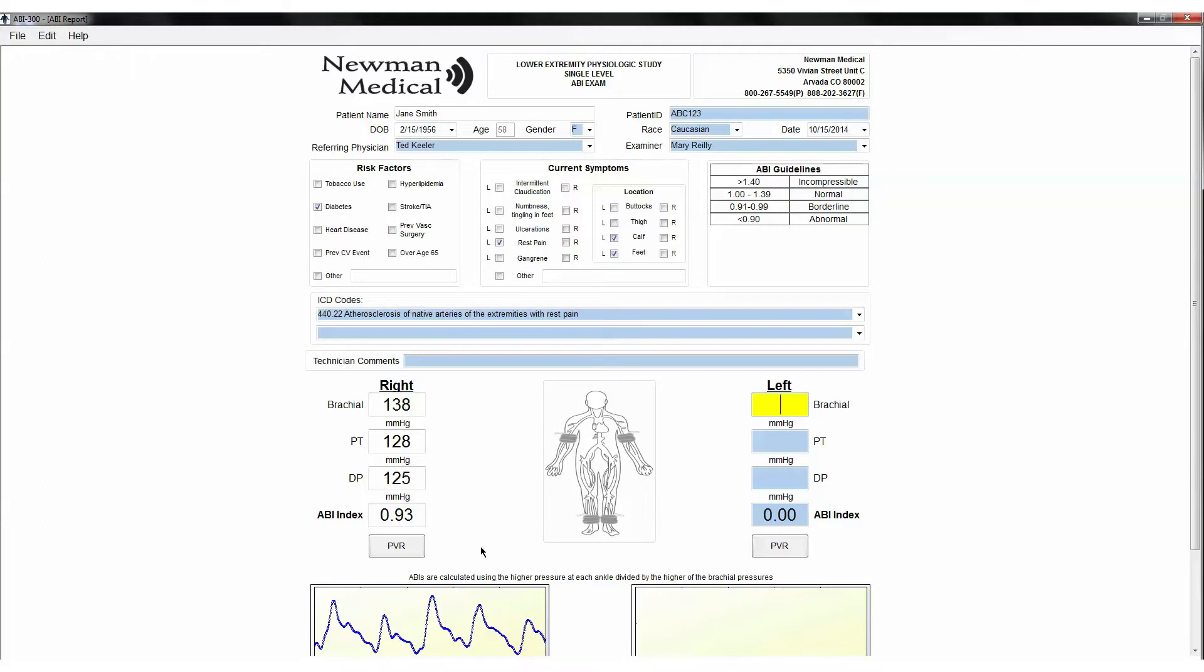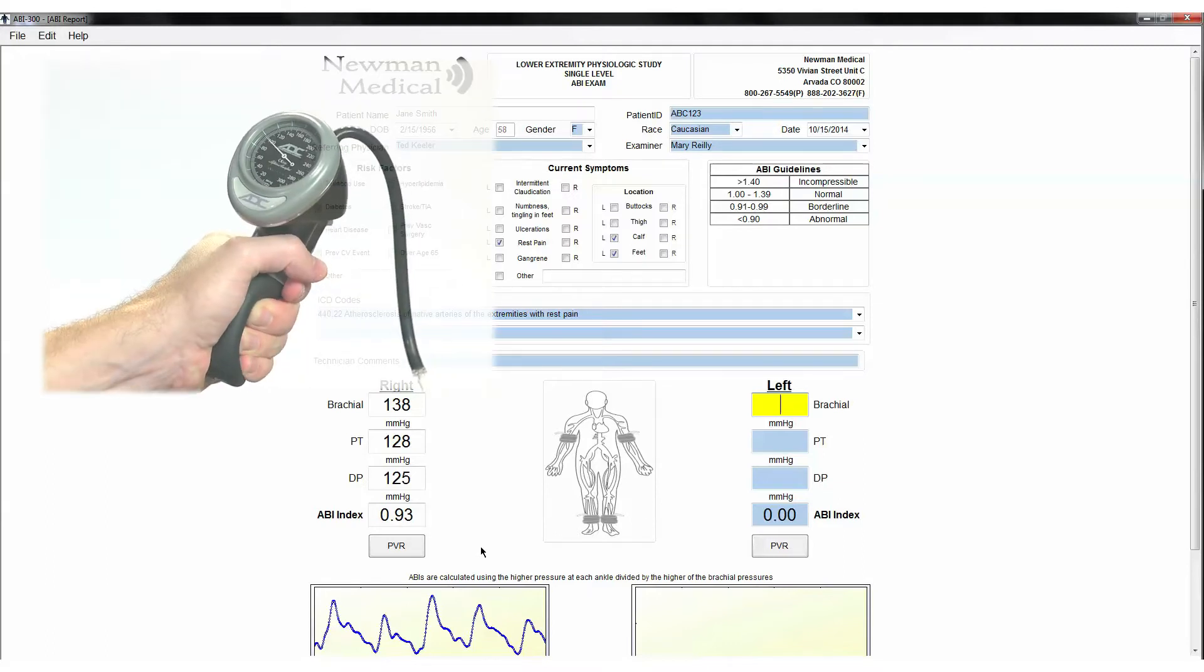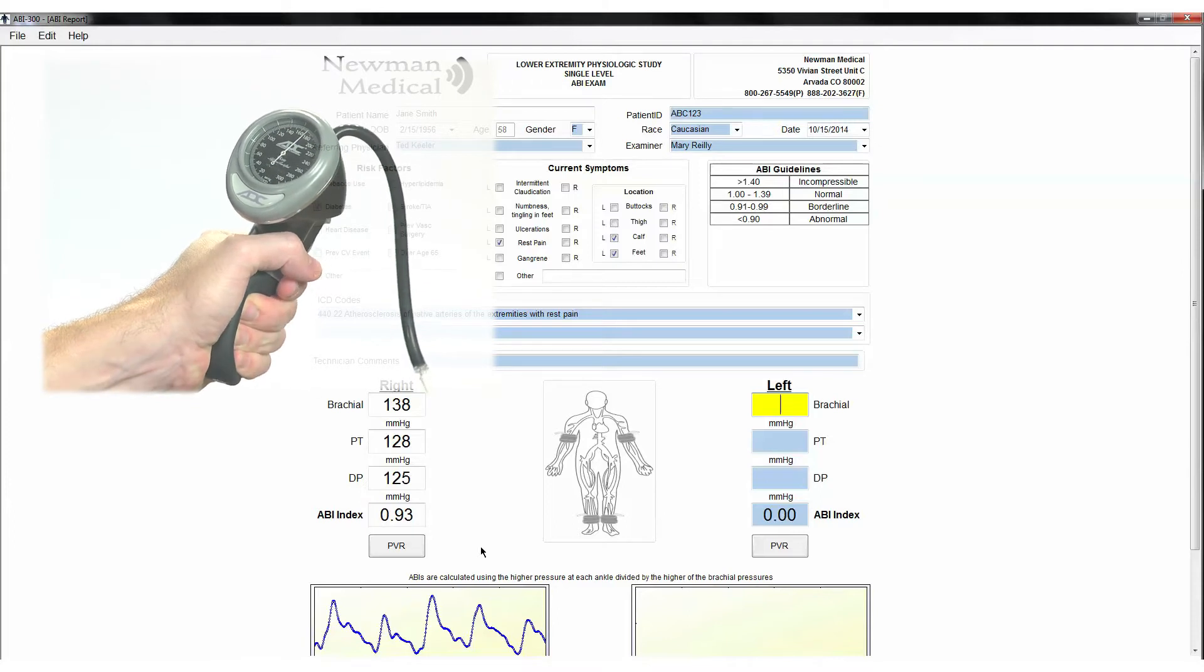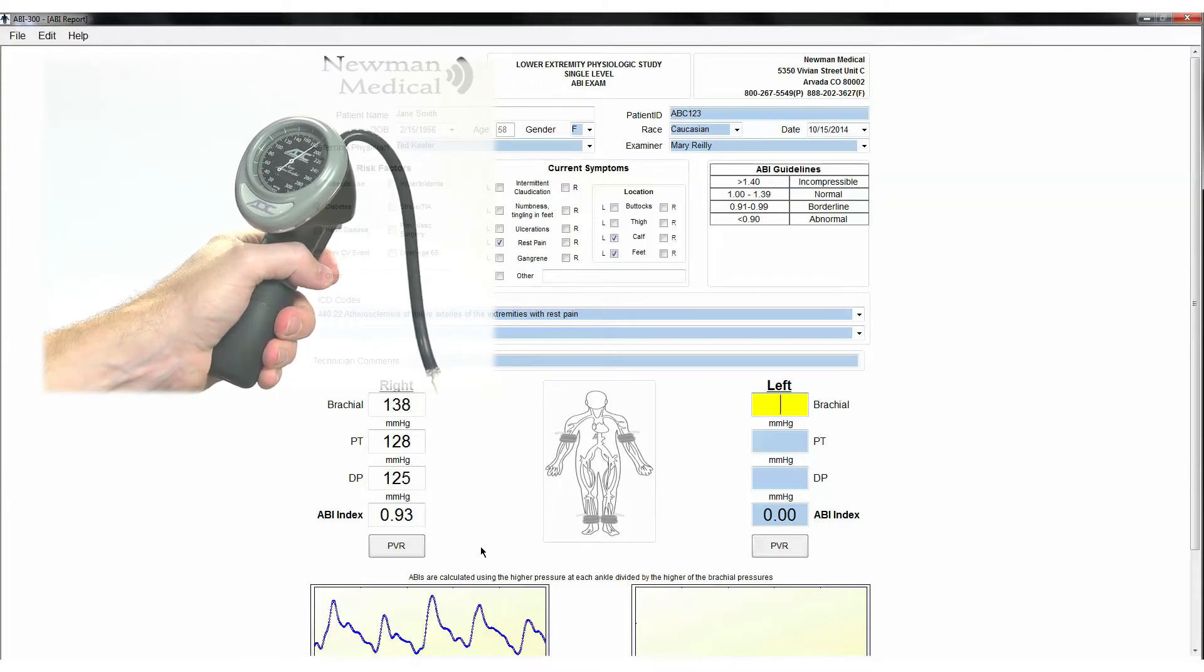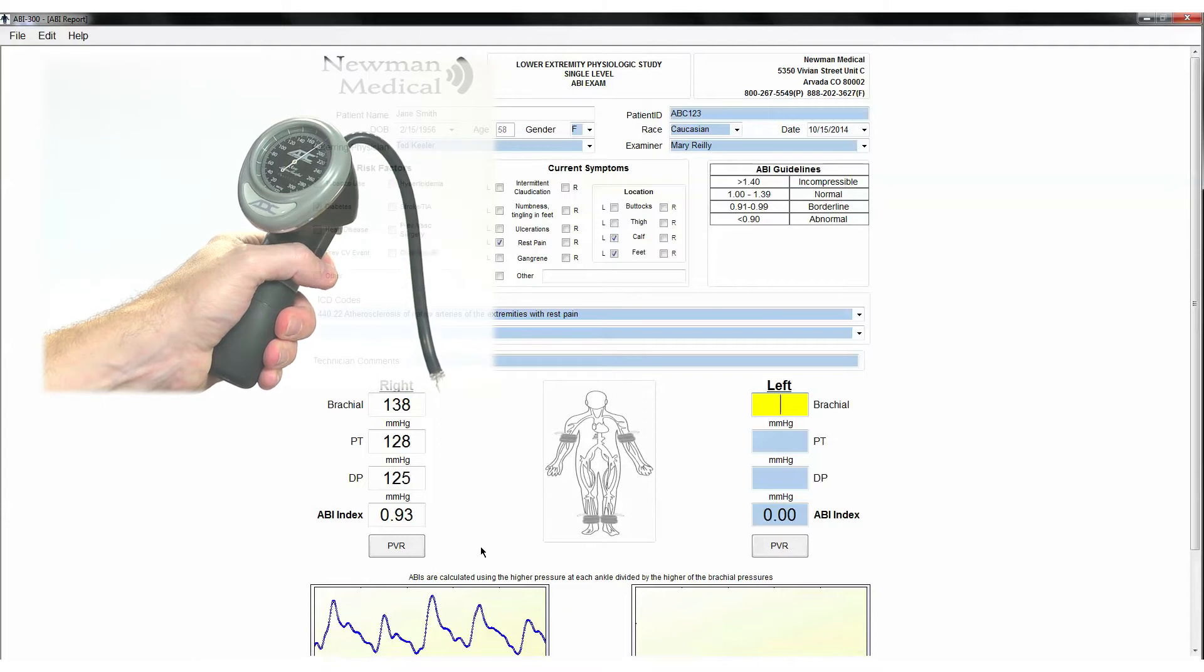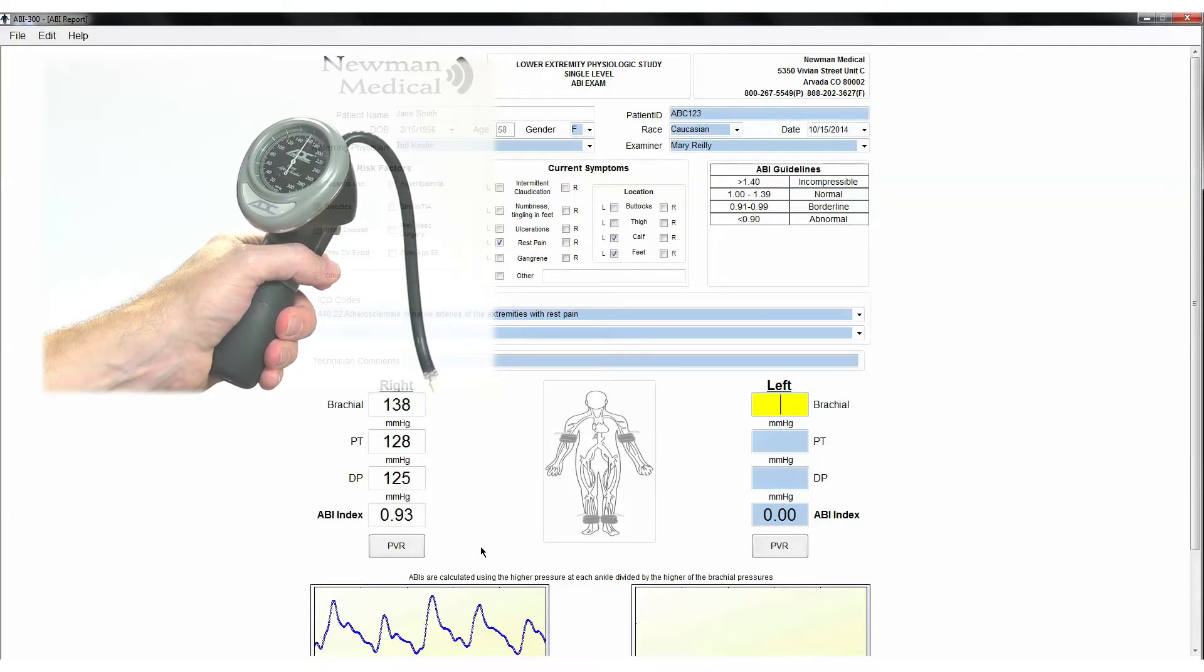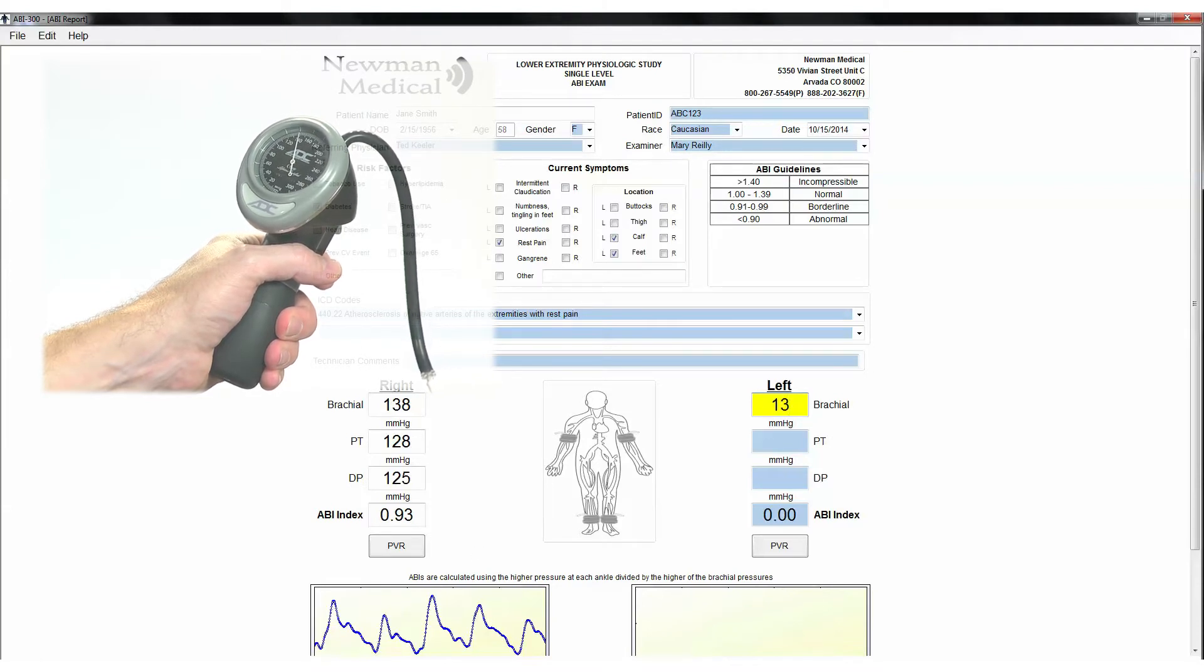Find a good Doppler signal at the left radial or brachial artery. Inflate the cuff until you no longer hear the Doppler signal and continue for an additional 20 mm. Deflate the cuff at 2 mm per second until you hear the Doppler signal return and note the pressure from the aneroid. Enter that pressure in the left brachial field.